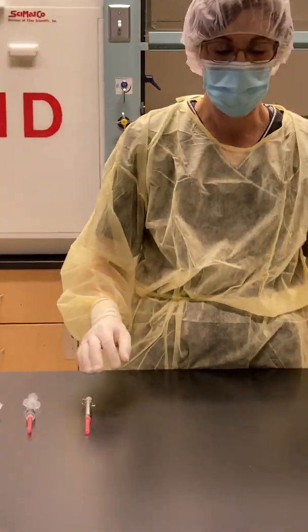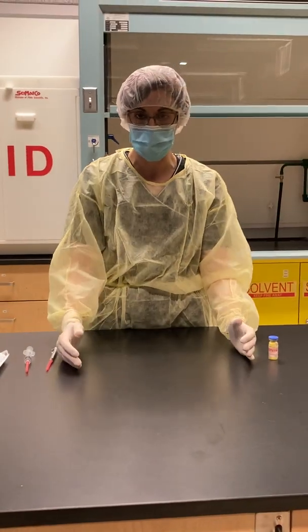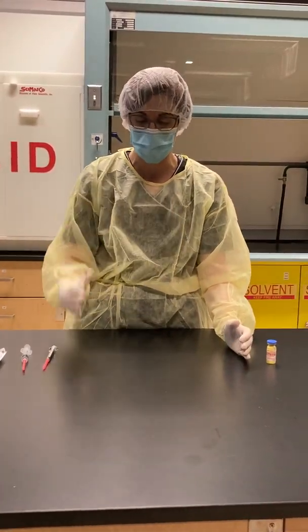It's also important to note that you should only keep what you need at the time of compounding in your work area. Your work area is considered the space between your shoulders.